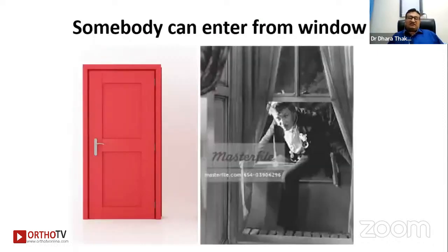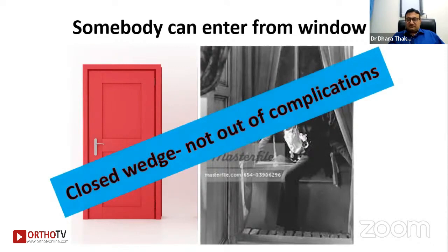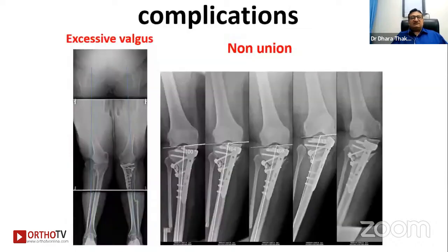So it's not free of complications. The complication is always there. Not always, but there are also a few complications which we can face. This is the excessive valgus which I have faced in my practice, and this is the non-union.